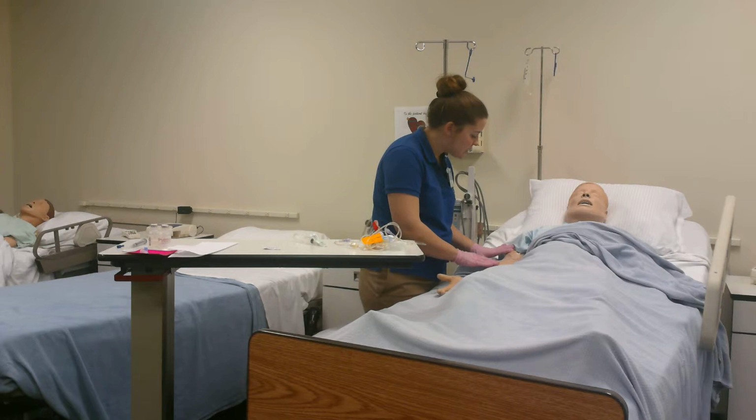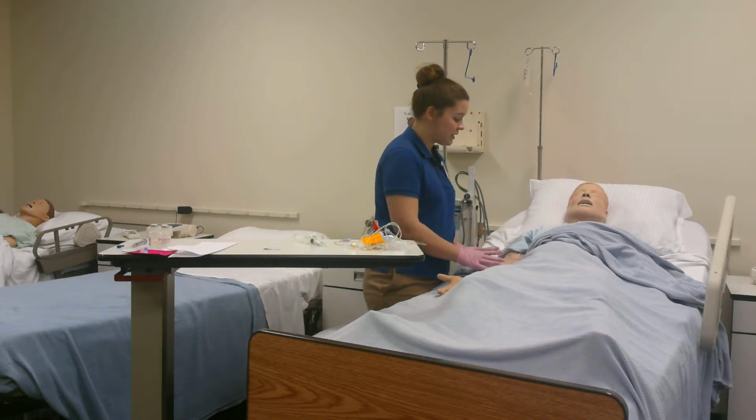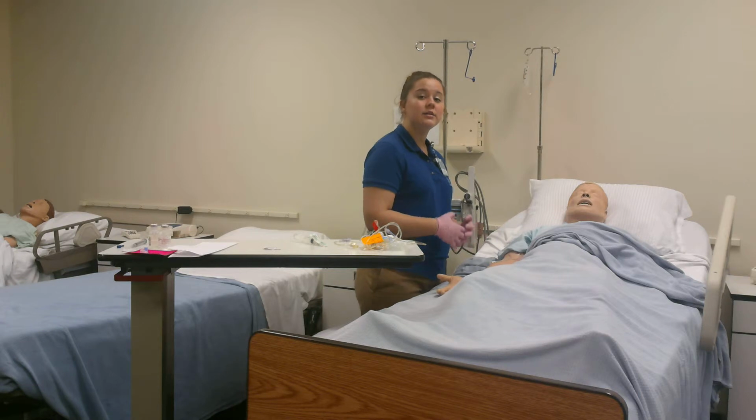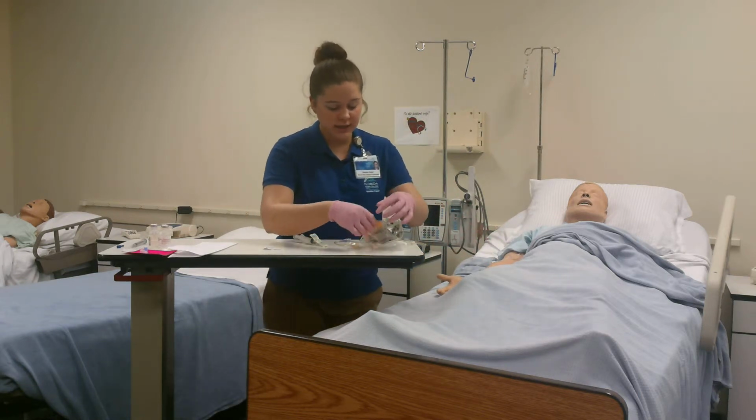Okay, Mr. Jackson, is it giving you any problems, any tenderness? I see no swelling. It's not hot to the touch or warm. And I see no signs of redness, so everything appears normal, so we will proceed. Okay, and I have your medication right here.